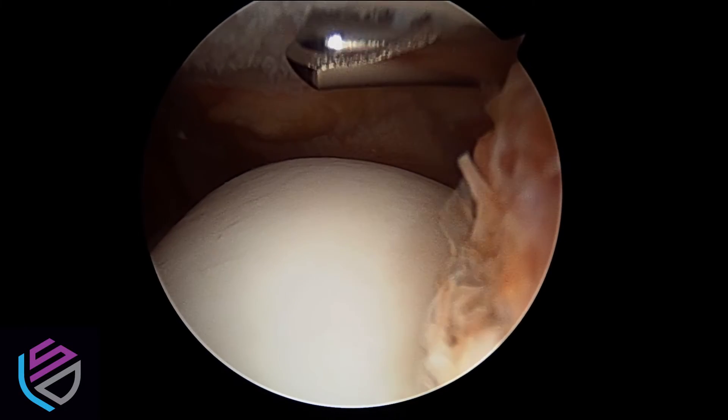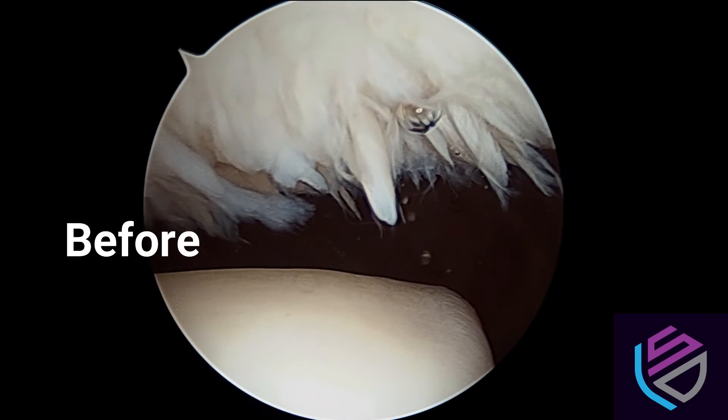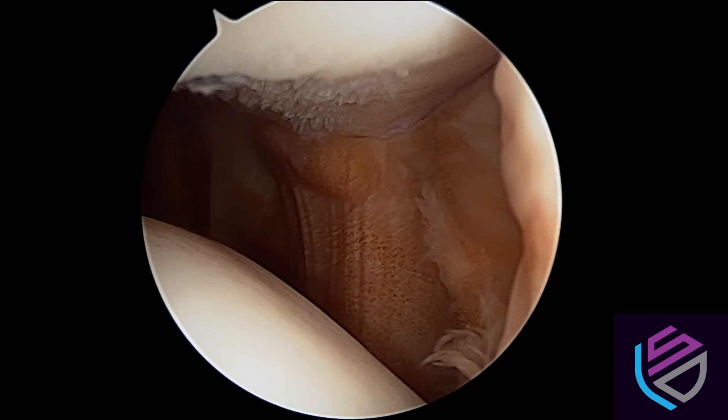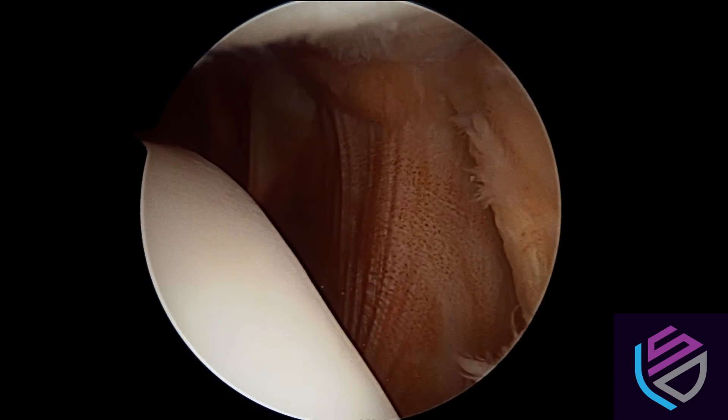As we approach the end of our cleanup, let's take a look back at the beginning where we started with some pretty severe damage to the underside of the kneecap. Our before images show a lot of fibrillation and significant damage, which we've improved to a great degree after debridement.